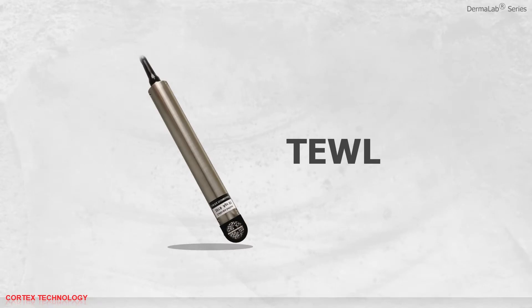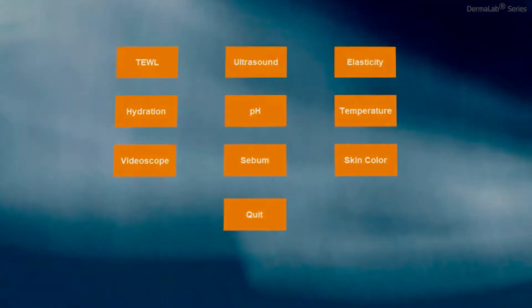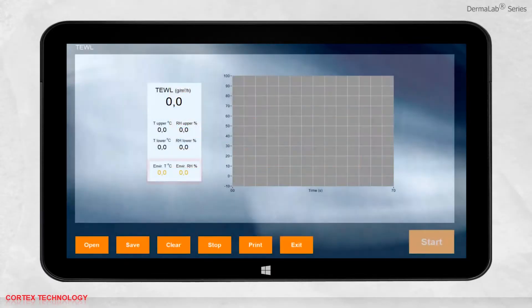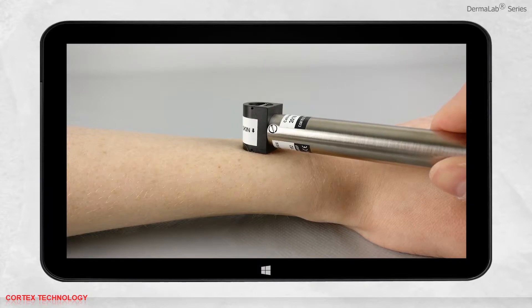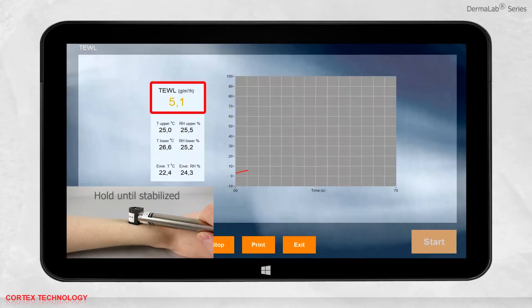The Dermalab Combo also features a trans-epidermal water loss application. Open the software and select the application. Upon entry, the environmental temperature and the relative humidity are calculated. You are now ready to perform a measurement. Place the probe where the measurement should be performed, applying only light pressure, and press start.